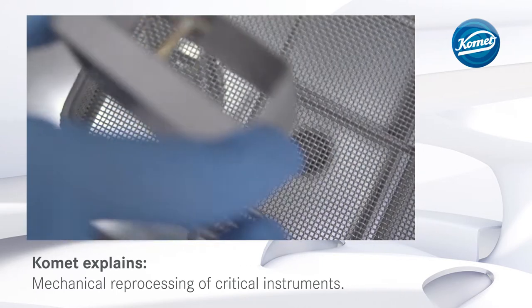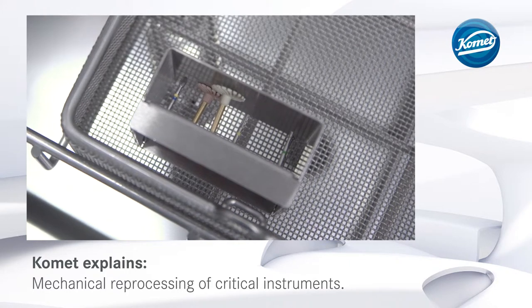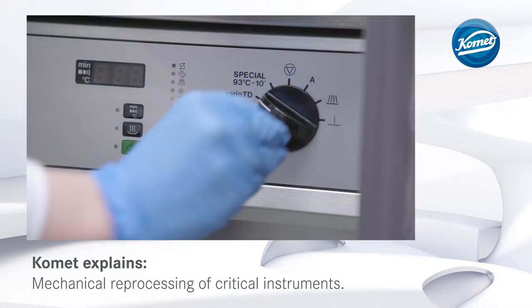The burr block is then placed into the top basket in a vertical position to make sure that the water jet reaches all areas. Once the thermo-disinfector has been filled, set the machine to the correct program.